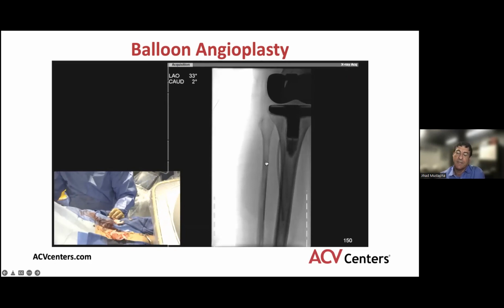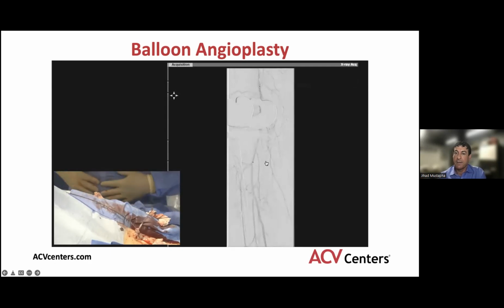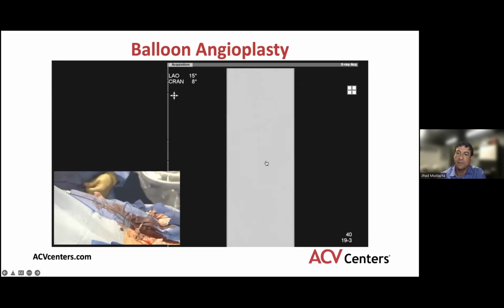As it is, based on the Bowman paper, balloon angioplasty alone caused significant recoil in tibial arteries within 15 minutes. So if you can actually use the atherectomy slowly like we did, plus prolonged balloon inflation with a balloon size that is probably 1.1 to 1, that is going to be the best option. And this is a great result here.